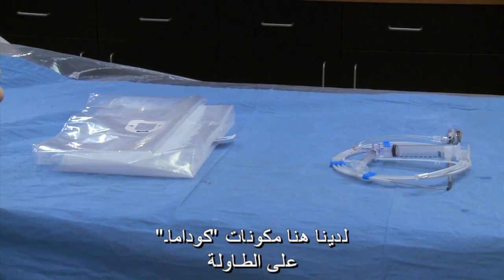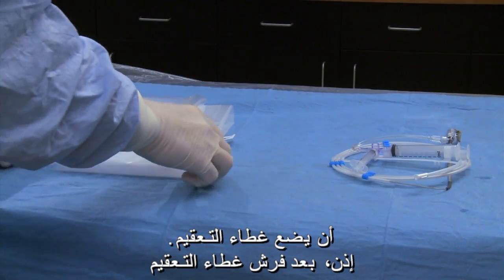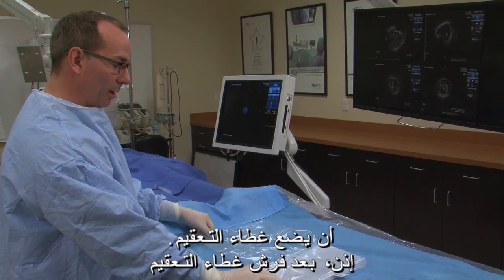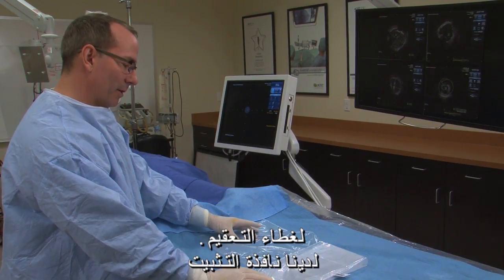We have the Kodama components on the table. The first thing we want to do is ask the sterile person to lay out the sterile cover. By unfolding the sterile cover, we can see the three components of the sterile cover.